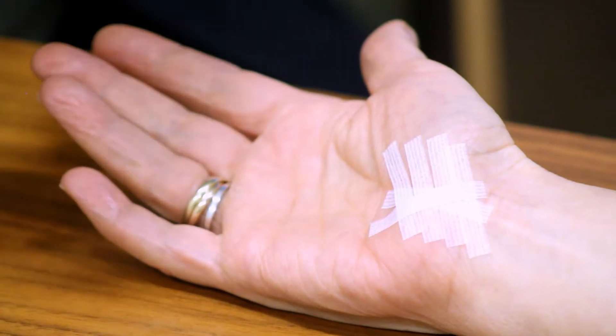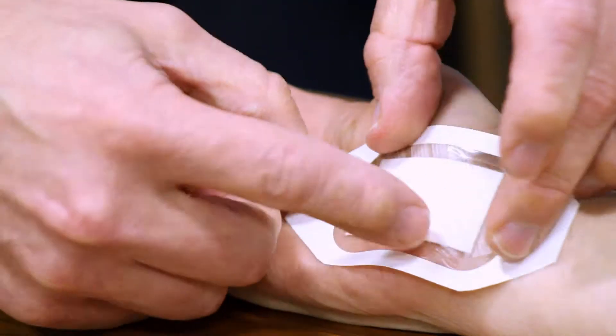And then we'll put on a sticky dressing. This is a Tegaderm, but we use lots of different types of dressings. And we apply that on the wound like this.